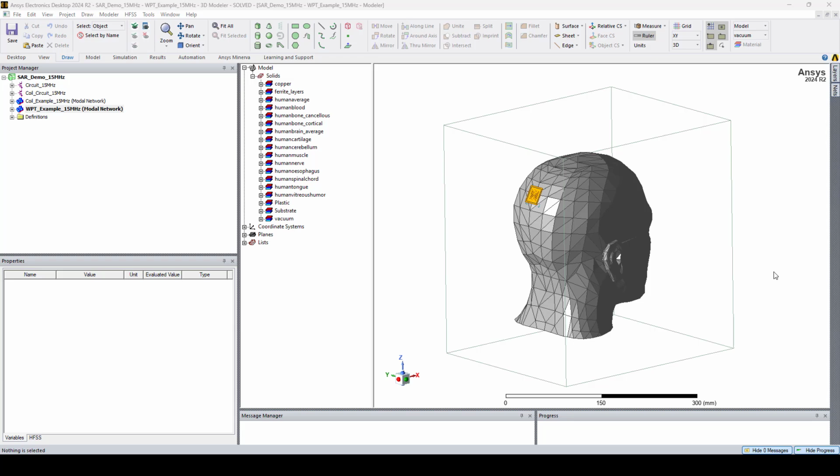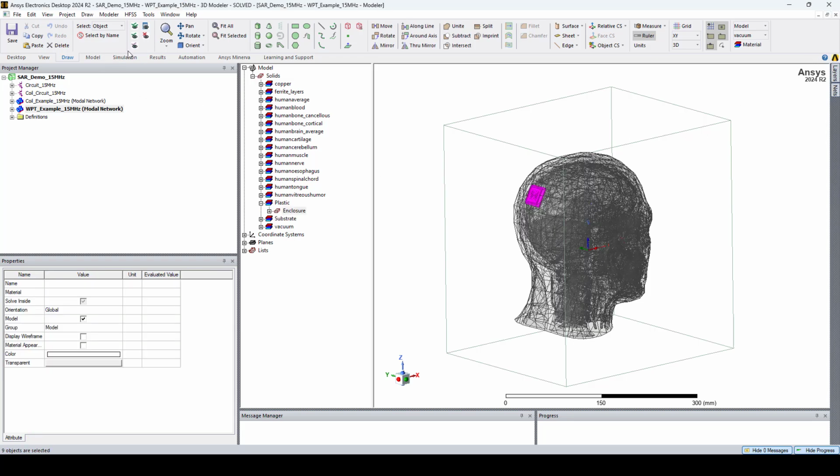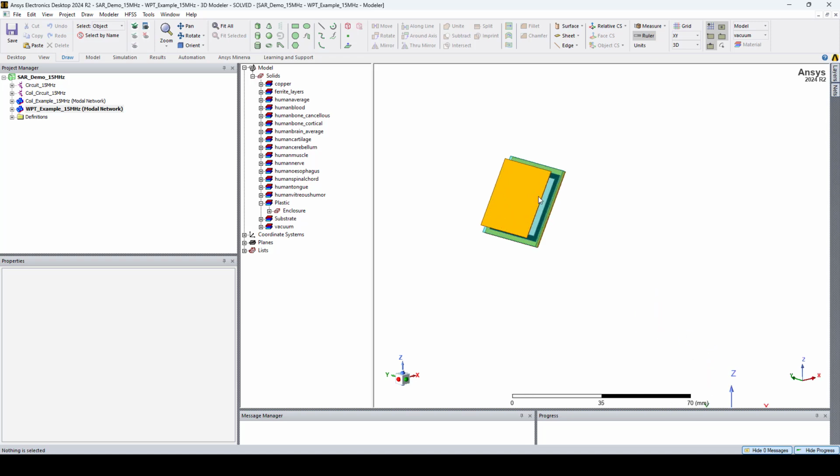In this video, I'll give you an overview of wireless power transfer and specific absorption rate simulation in Ansys HFSS. In this example, a wireless power transfer system operating at 15 MHz is simulated with the Ansys head model. Here we have two coils, a transmitter which is external, and a receiver which is implanted in the head.